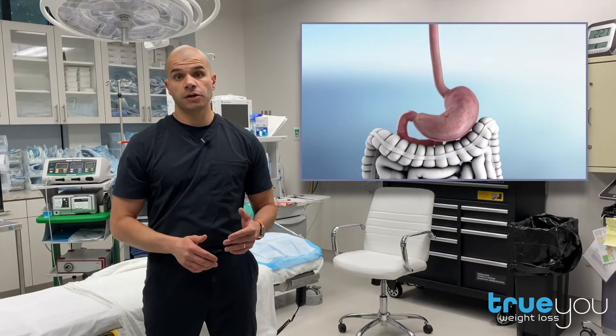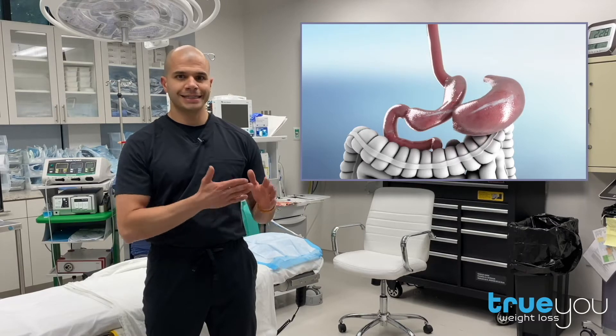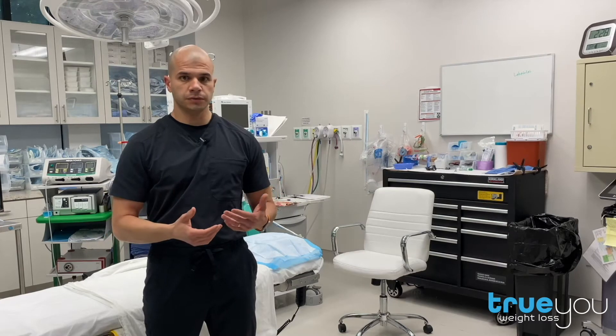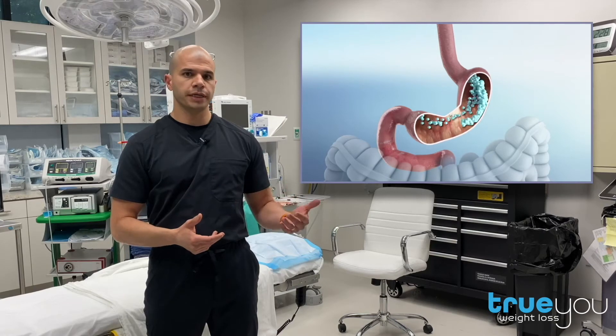Sleeve gastrectomy is currently the most commonly performed bariatric surgery. During the surgery, the stomach is stapled and divided, creating a narrow tube-like stomach. This allows you to eat less, feel full, and lose weight. However, over time, we know that the sleeve can stretch out, which can lead to weight regain.